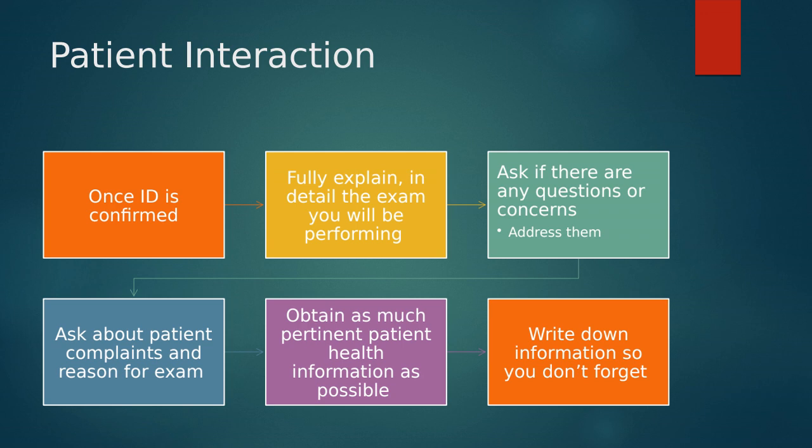You're the one performing the exam, so you need to be the one to make sure that you fully explain it to them and that you allow them to ask any questions if they have them. So if we are doing an abdominal exam, you want to make sure you're saying, okay, we're going to be scanning around on your abdomen. I'm going to be taking a lot of pictures as we go. I'm going to have you do different breathing instructions. I may have you change position a little bit for certain pictures, and then make sure they don't have any questions.